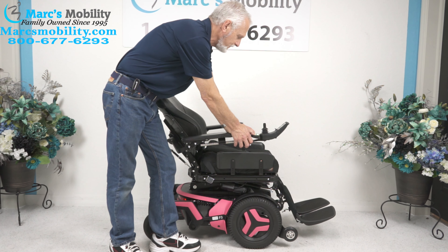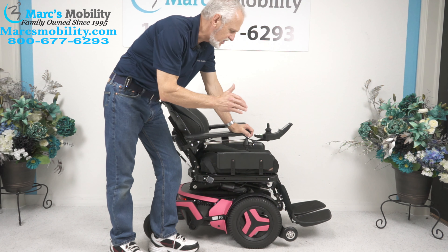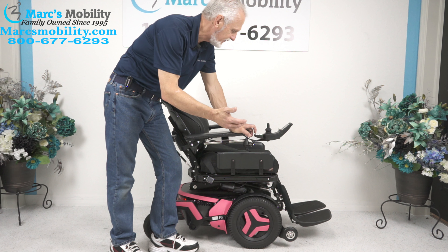This chair is fully adjustable. If you wait and watch until the end of the video, I'll be driving the chair outside so you can see how well it does outdoors.